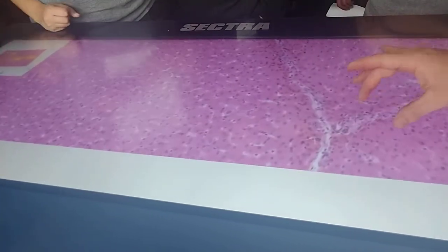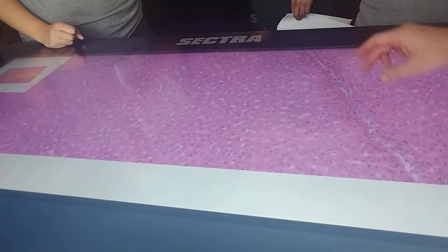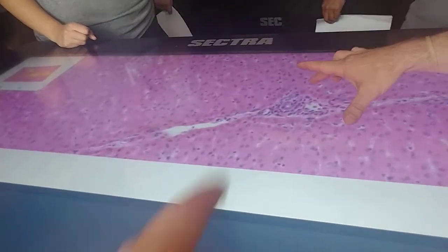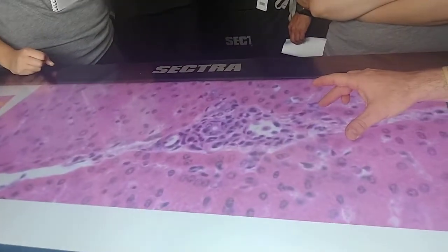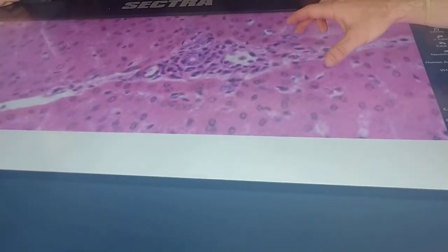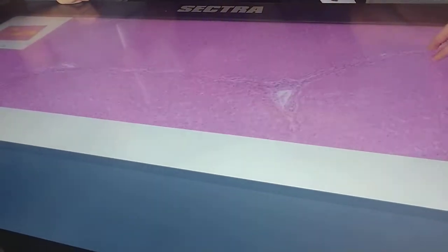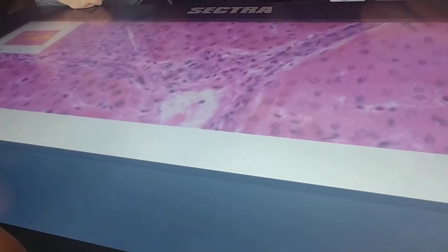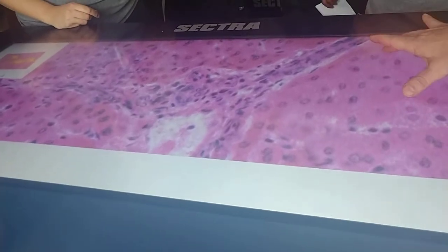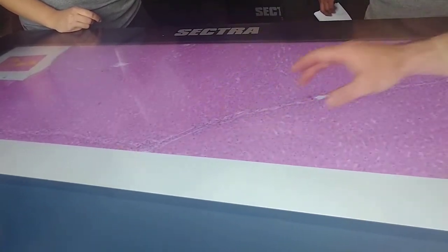Shucks. All right. I think that's it. Yeah, that's it. The same area. Let's see if I can find one. I just want to see real quick. They're all about the same. We'll go back down because we were on that one.